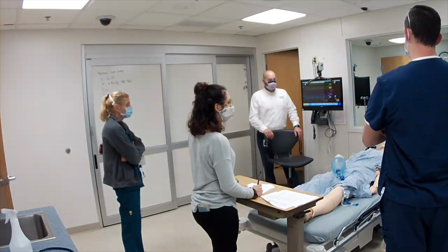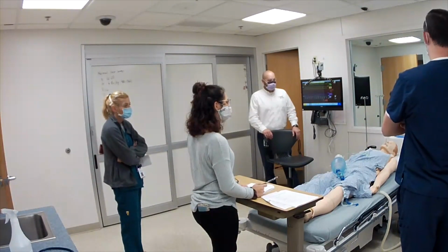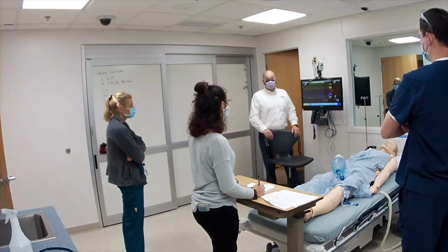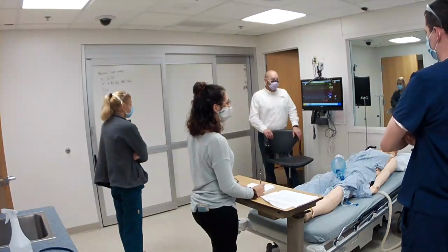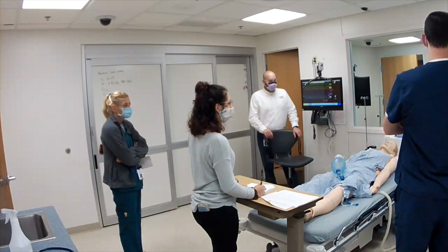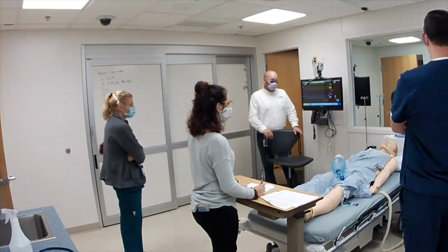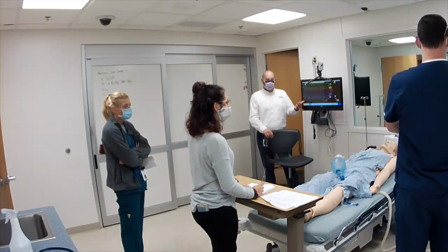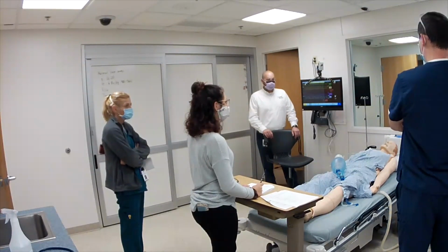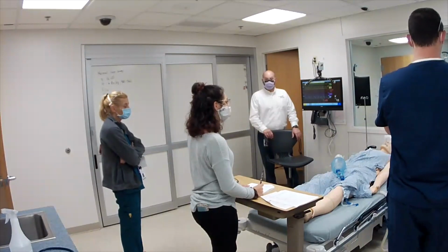What's the next one? FiO2. Okay, I set that and I know Stanley didn't generate his own oxygen. So, pretty sure. Right. I didn't miss that lecture in anatomy. So why are we measuring FiO2? It's got to be what I set, right? To ensure the machine's giving what you set. Yeah, absolutely. Just a safety check-in system, right? So if we had an empty O2 cylinder, or even the gas coming from the wall was not right, then we have a safety in our system to make sure that we are doing what we say we're doing.